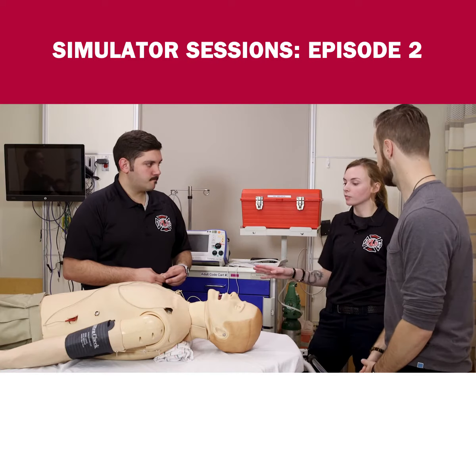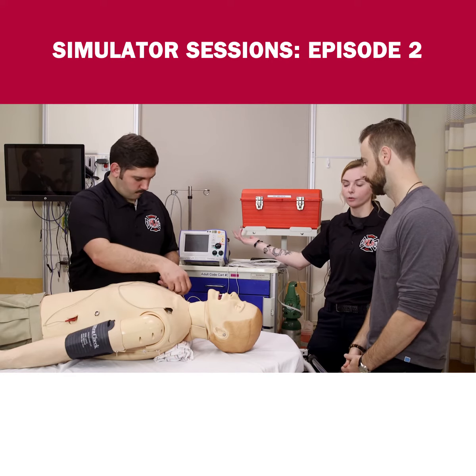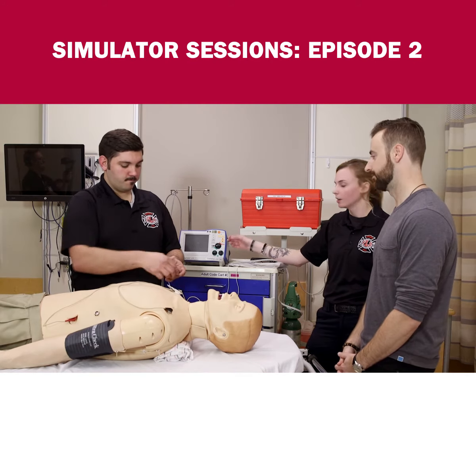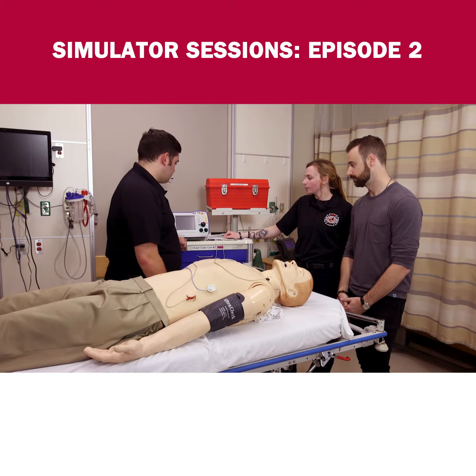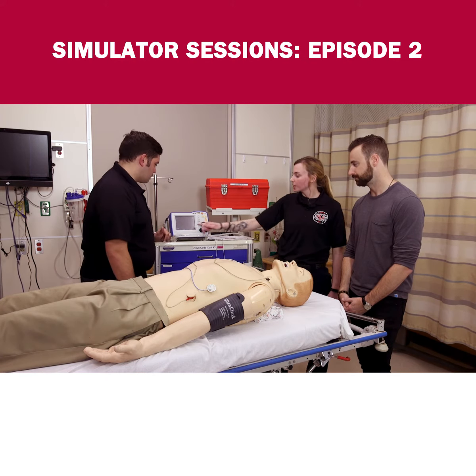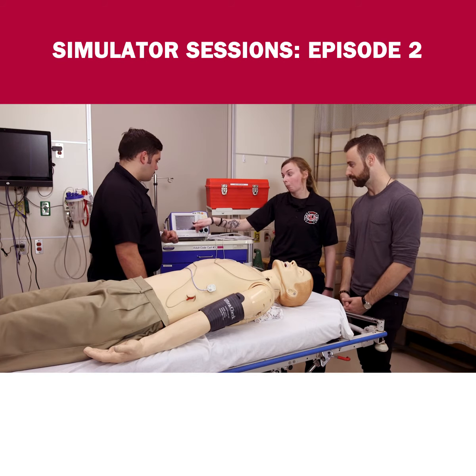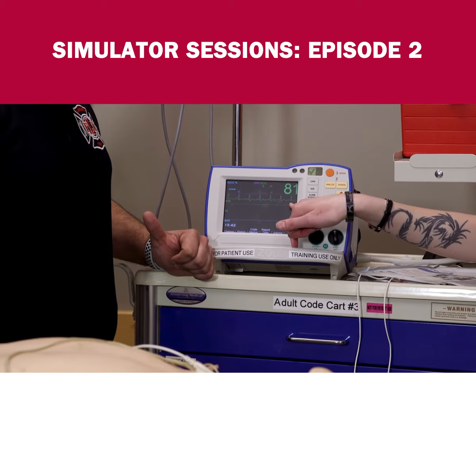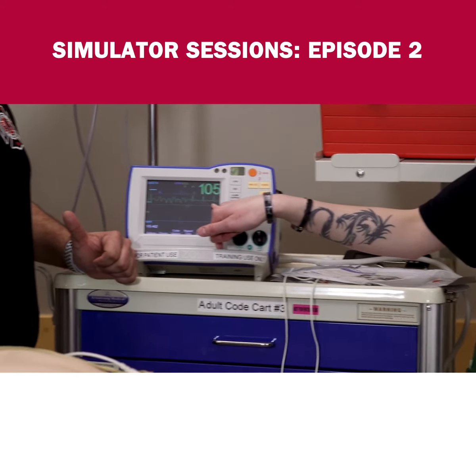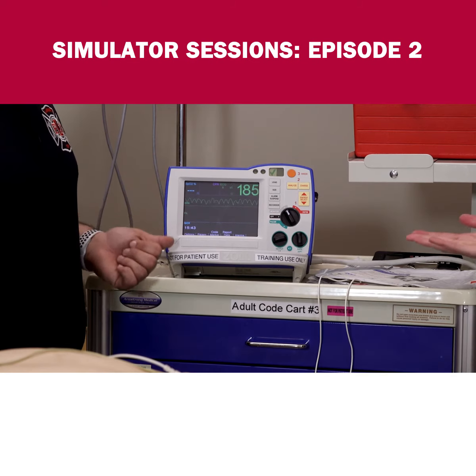Once we have the leads on, it's not doing us any good if we can't see anything on the monitor, so we're gonna turn the monitor on and monitor this heart rate. Taking a look here — pretty normal, pretty consistent, 79 beats per minute. I like it; makes my job easy if it looks like that.